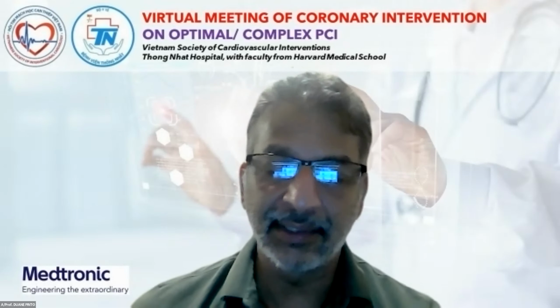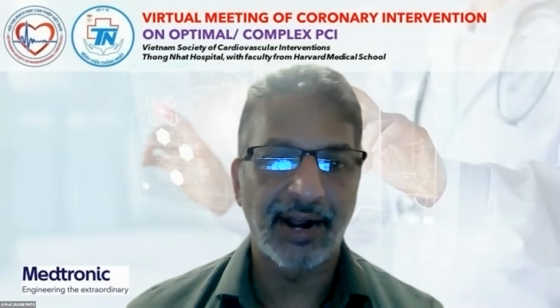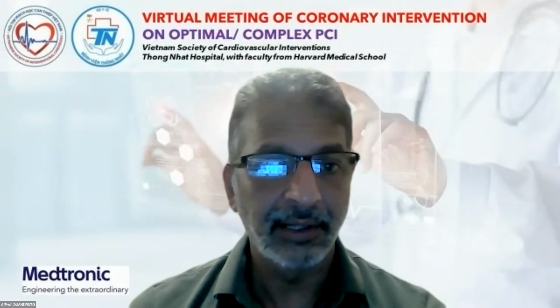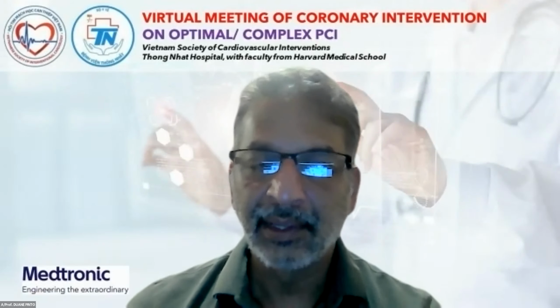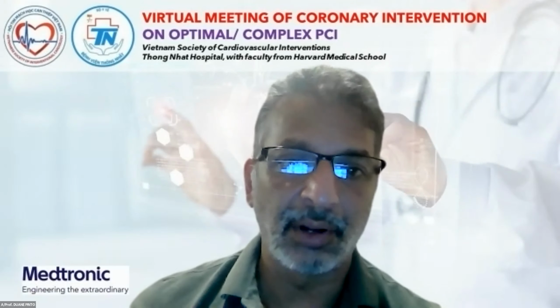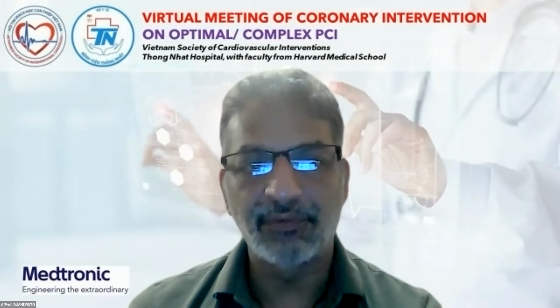And I tend to not use it simply because someone has a reduced ejection fraction and complex anatomy. They have to have some evidence that they are in heart failure, with elevated filling pressures and/or reduced cardiac output. And if I'm going to rotablate a very extensive area, like in this case, the anterior wall, I will be more free about using an Impella.